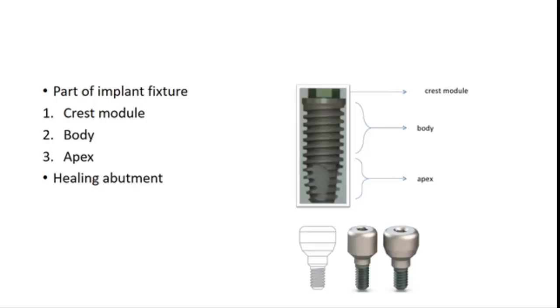The sutures are removed, and the cover screw is exposed by different methods, which will be dealt with in the second part of the same chapter.